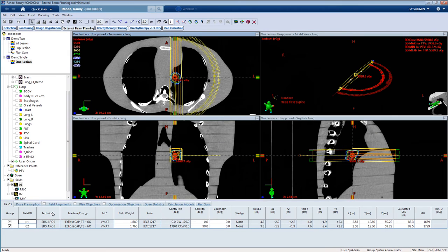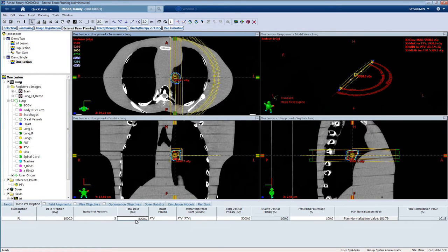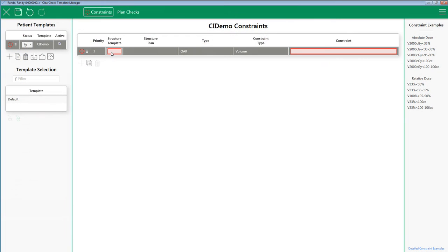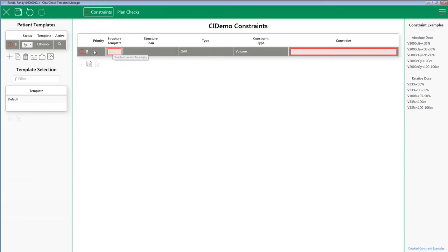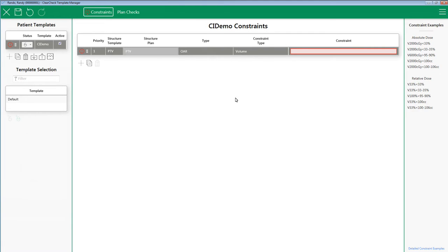To start, we are going to look at a single lesion SBRT lung. The prescription dose is 5,000 cGy in 5 fractions. Here I am in the Patient Template Manager for ClearCheck. Let's start by adding a blank constraint. Remember, Structure Plan is the structure list coming from the Eclipse Data Structure Set. So for this example, I am going to pick PTV.